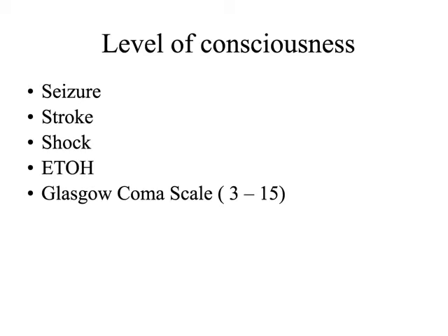If the patient is drunk or in some way mentally impaired, whether it's pathology like Alzheimer's dementia or a mental disability or something like that, I am going to need to tailor my CT scan a little bit to their specific needs, right? If I have a patient, for example, who has Down syndrome, I need to understand they're probably very afraid of everything that's going on. They probably have had a lot of terrible experiences in hospitals, right? So I need to do the best that I can to explain things as simply as possible.